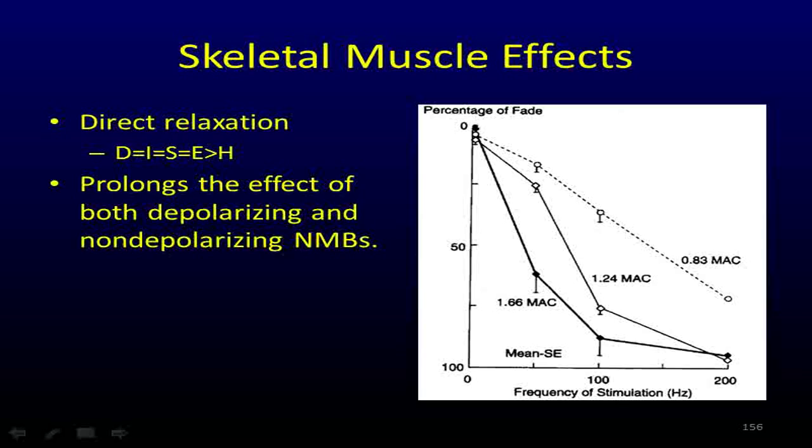It releases the acetylcholine, right? It interacts with the SNAPs and the SNAREs, all that stuff you're going to have to learn. The acetylcholine gets released, and bam, you get a twitch. And the rest of the calcium causes the next round of vesicles to mobilize. So with each twitch, it measures the ability to both release and mobilize acetylcholine vesicles.